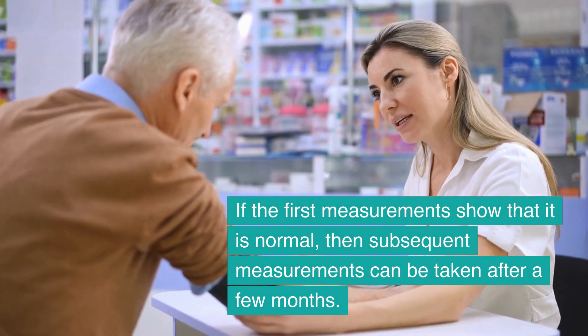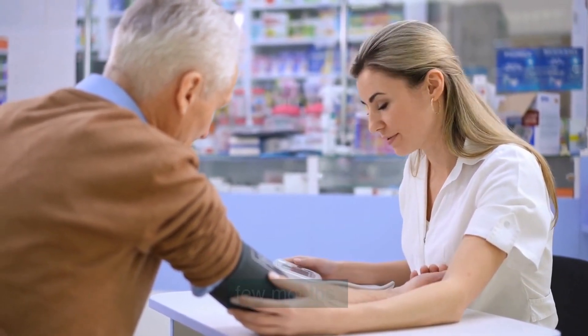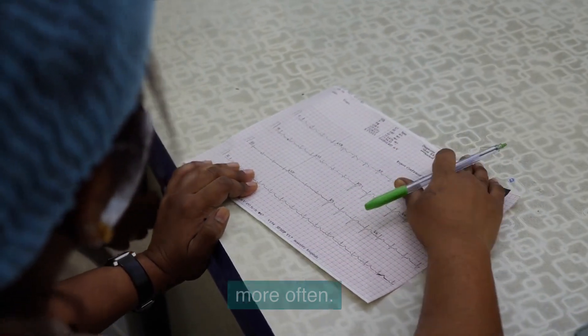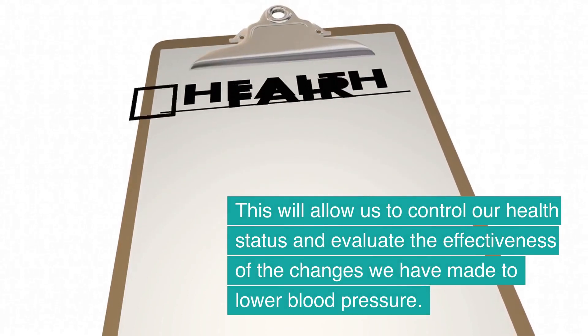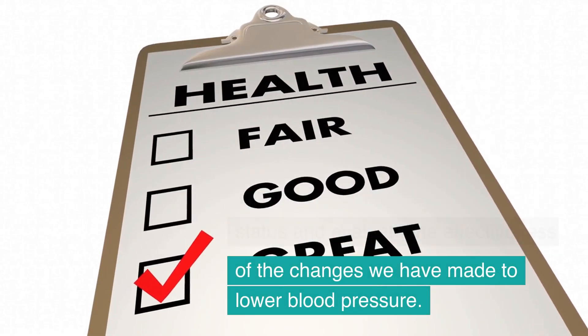I believe it is worth regularly monitoring our blood pressure. If the first measurements show that it is normal, then subsequent measurements can be taken after a few months. However, if the blood pressure was elevated, it is a good idea to check it more often. This will allow us to control our health status and evaluate the effectiveness of the changes we have made to lower blood pressure.